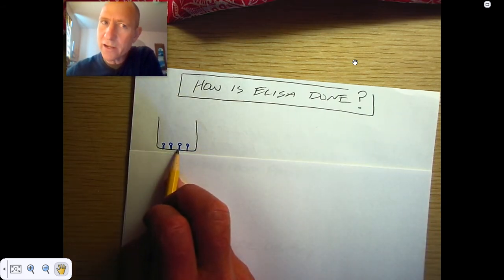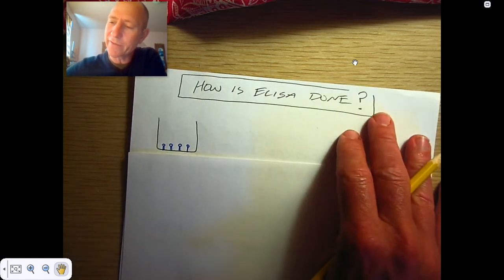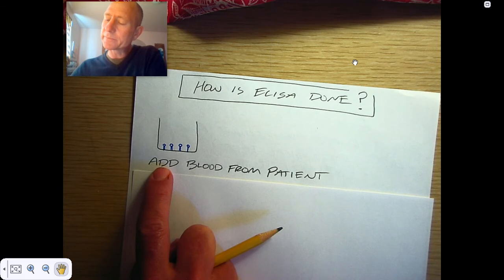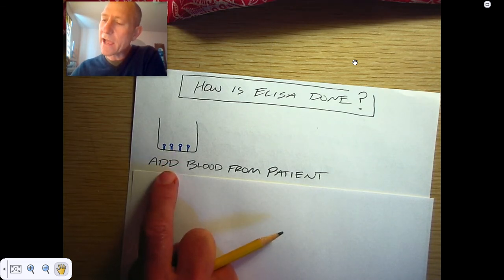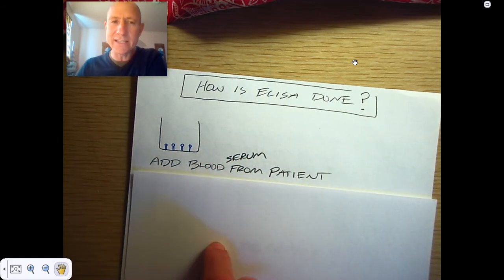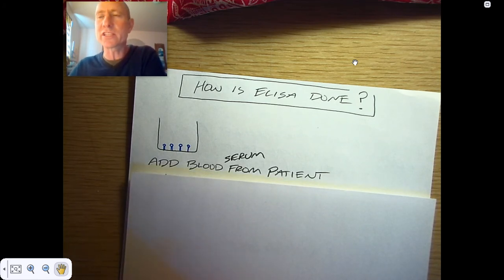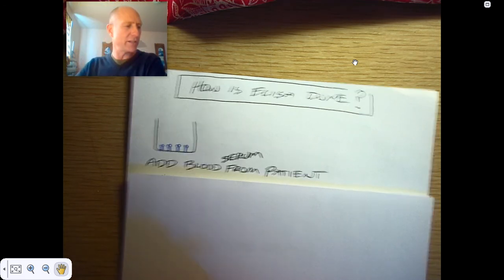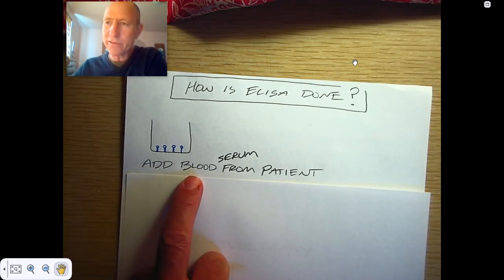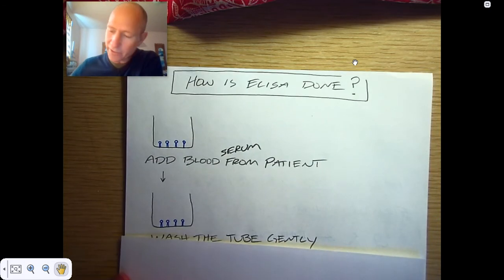This coronavirus did not come from a coronavirus patient. This coronavirus came from the lab where it was manufactured. So we can, to this test tube, we can now add blood serum from a patient. So blood serum is the blood, all the parts of the blood that are not cells. So you just take the blood, spin it down, get rid of all the cells, and then add the serum to this tube right here. So here we are adding that serum to the tube.